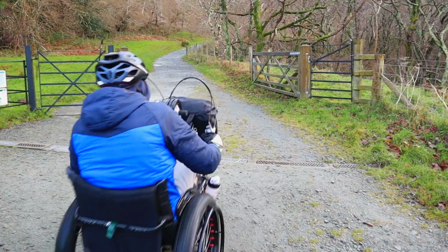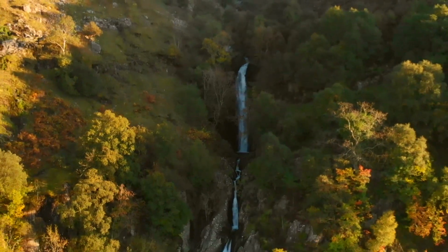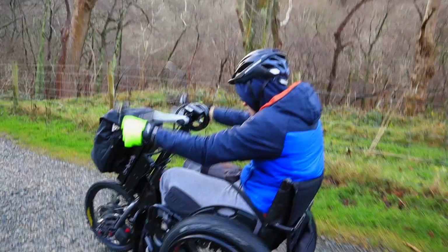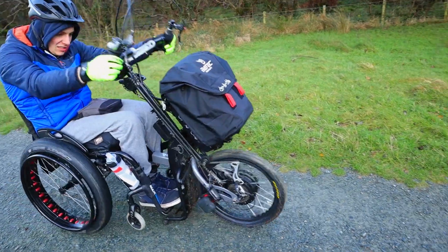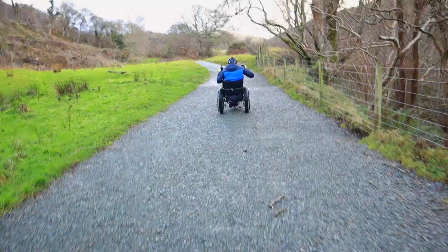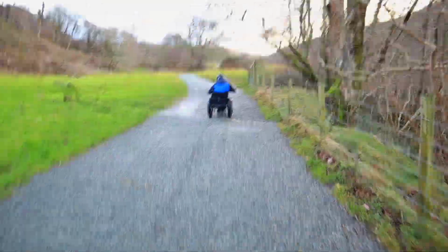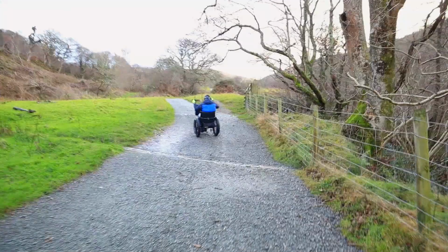So we are walking up to Aber Falls, which is a waterfall in North Wales. And we thought this would be a good opportunity to test out how the Batec can cope with this sort of slightly hilly, gravelly terrain. This is somewhere that we've been wanting to go for a while, but we haven't gone to before because we thought it would be very difficult to get to in Craig's manual wheelchair alone without any sort of power assist. So now that we've got this, we thought we'd try it out and see whether we can get there.